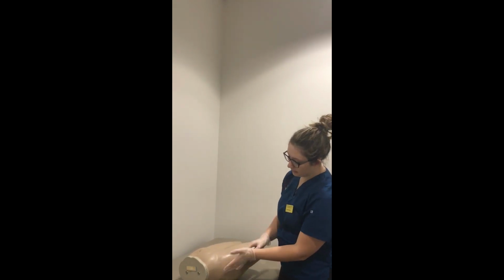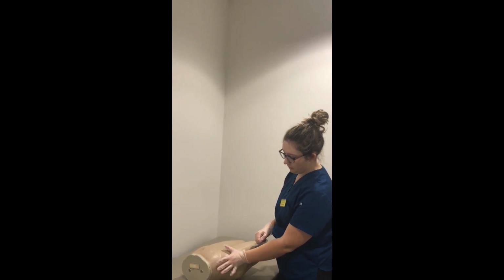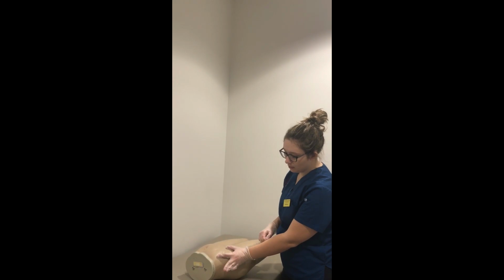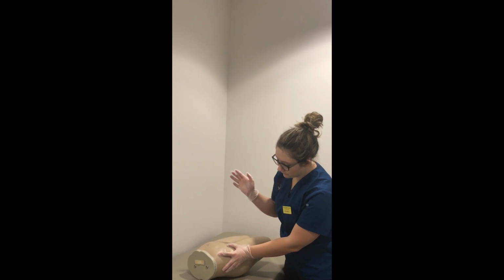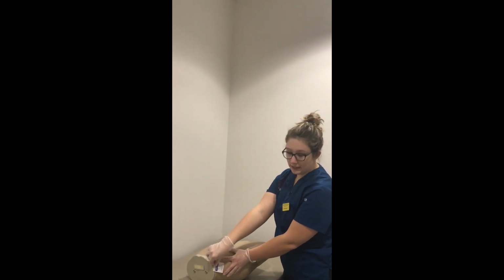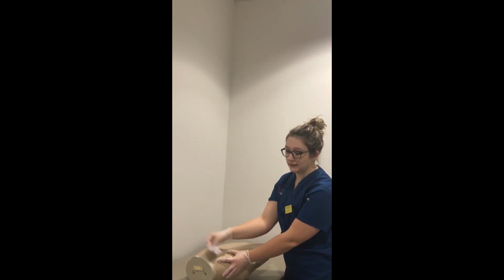Next, I will landmark where I will be doing the injection. So with my left hand, I will put the heel of my hand on the greater trochanter of the hip. My thumb will point towards the patient's groin. My index finger will be on the anterior superior iliac spine, and then the rest of my 3 fingers will go to the iliac crest surrounding the buttocks. So then I know that this is a general area to where I will be giving the injection. I can put an alcohol swab in place to cover the area, so then when I move my hand away to grab the injection, I still know where I will be going.